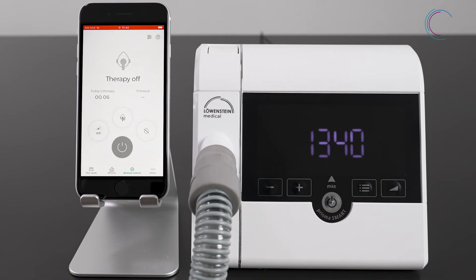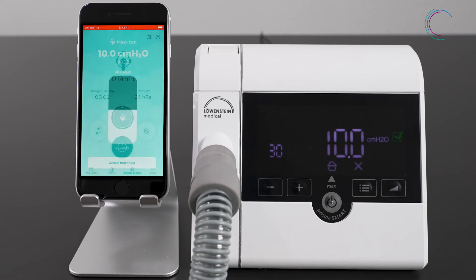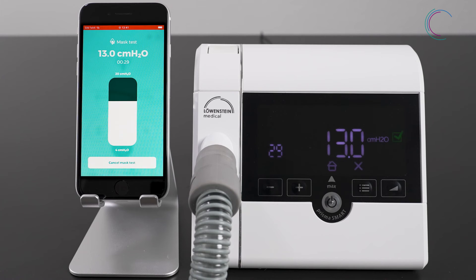You can start the mask test only if the therapy is running. So put on your mask and then start the therapy. After that, you can press the mask test symbol, and you can set the pressure you would like to apply. The mask test will last 30 seconds.